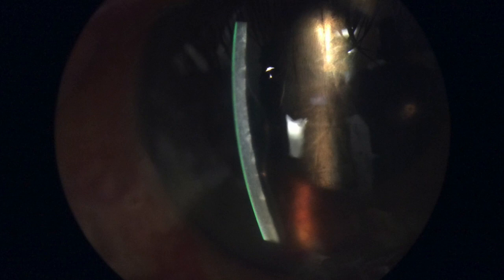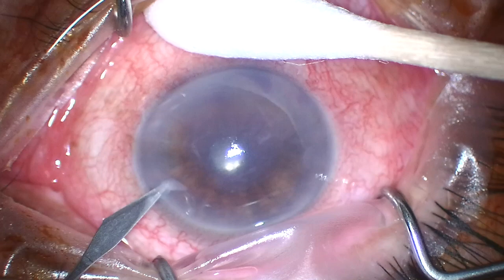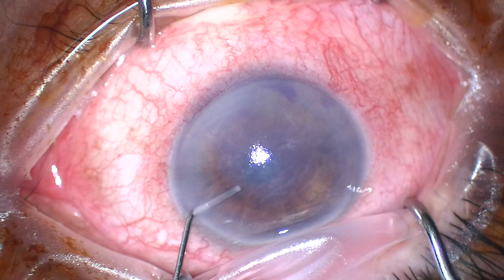On slit lamp, it was evident that there was a separation where Descemet's membrane was detached for most of the central cornea. We could not find any place where Descemet's was torn on slit lamp, so I assumed it was a detachment that occurred from the temporal incision, probably during hydration of the cornea at the end of the case. So I made my incision and paracentesis nasally.